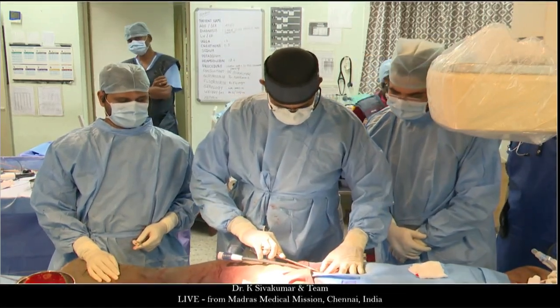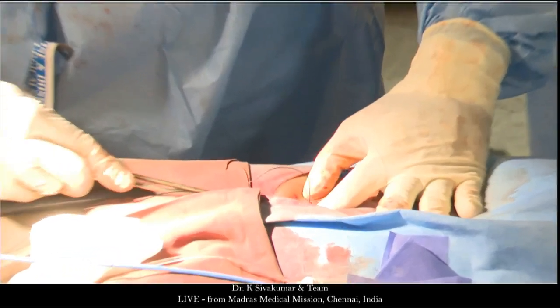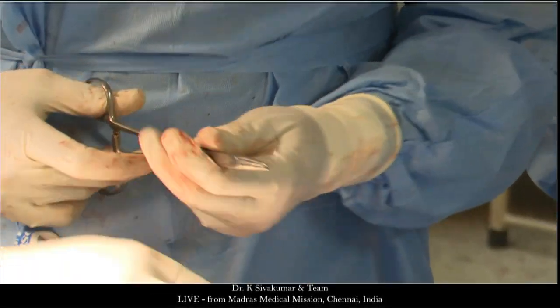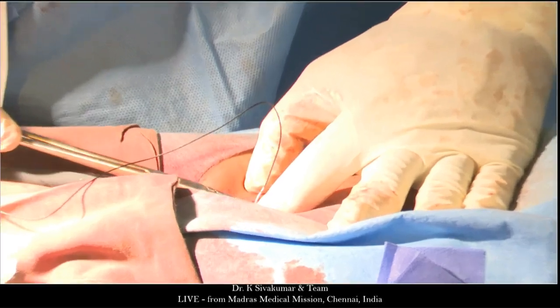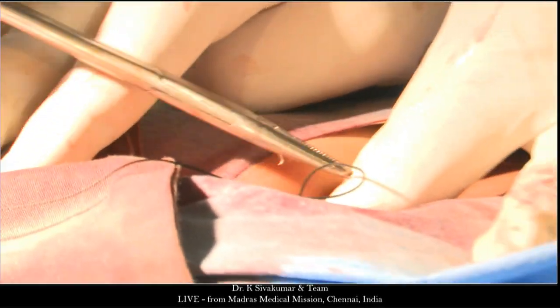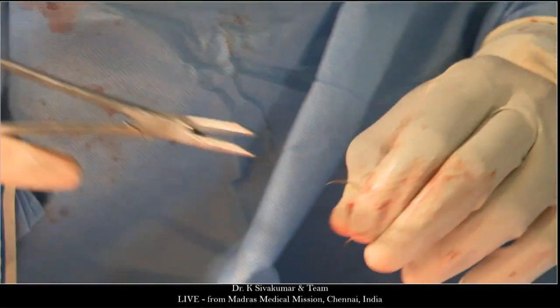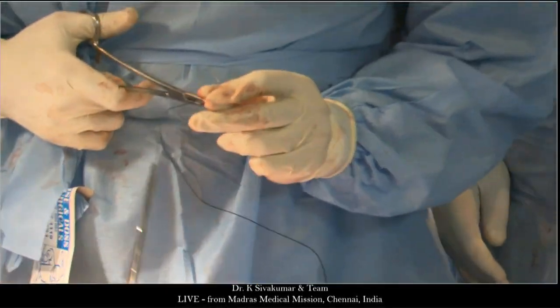Siva, regarding the ASD, is there a particular sinus venosus ASD that you say it's either too big or relatively too low that you will say, I can't do it? Does the ASD affect your decision on whether it's doable or not? Are you talking about an additional associated secundum ASD or the sinus venosus defect size itself being large? The sinus venosus, if the sinus venosus is really big.